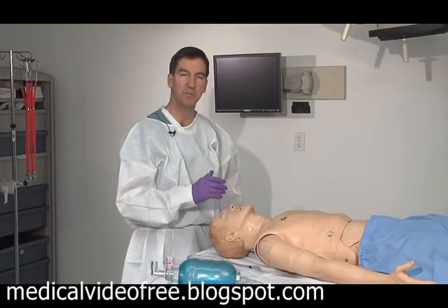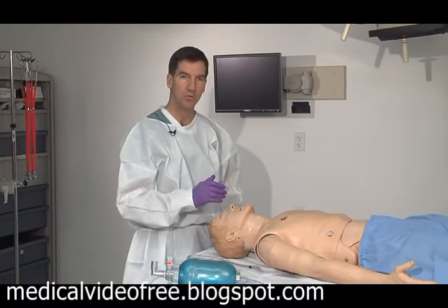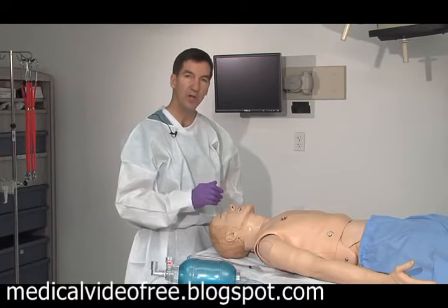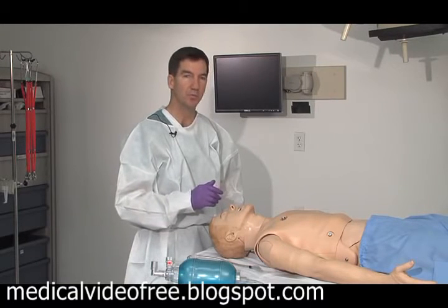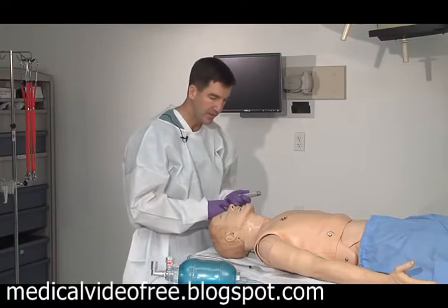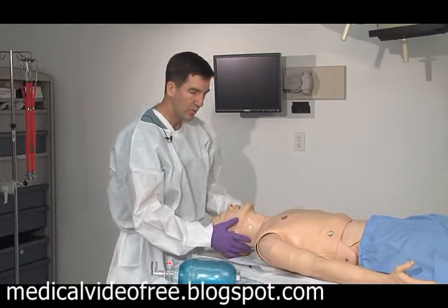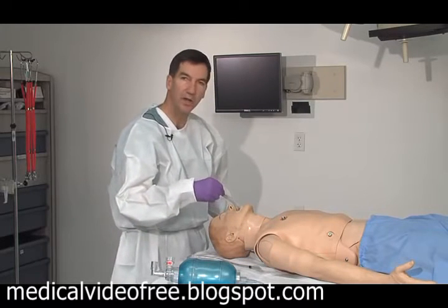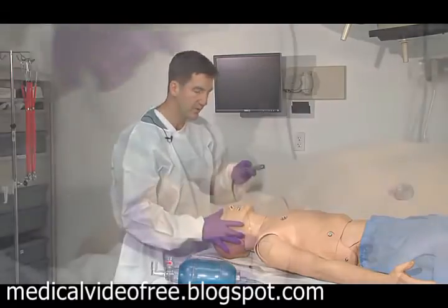Normally your resuscitation team would be bagging the patient. When you're prepared, the guideline is for the provider to take a deep breath and hold it, just as your patient will be holding their breath as you prepare to do your intubation. With the head slightly tilted, make sure that suction is applied so all the secretions are out of the way.